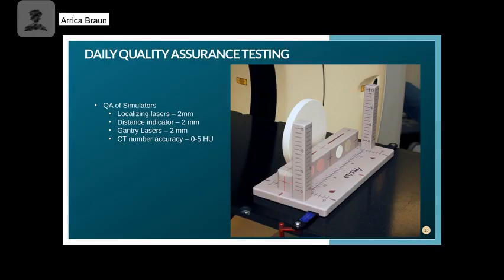Quality assurance is a huge thing in radiation therapy. And so we have some tasks that we have to do every day that we are going to be utilizing our linear accelerator or our imaging systems. So our quality assurance for simulators, meaning that's going to be our CT machine or MRI if you have that specialized version. We have to check our lasers every day. We have to check our distance indicators, gantry lasers, and then our CT number accuracy.